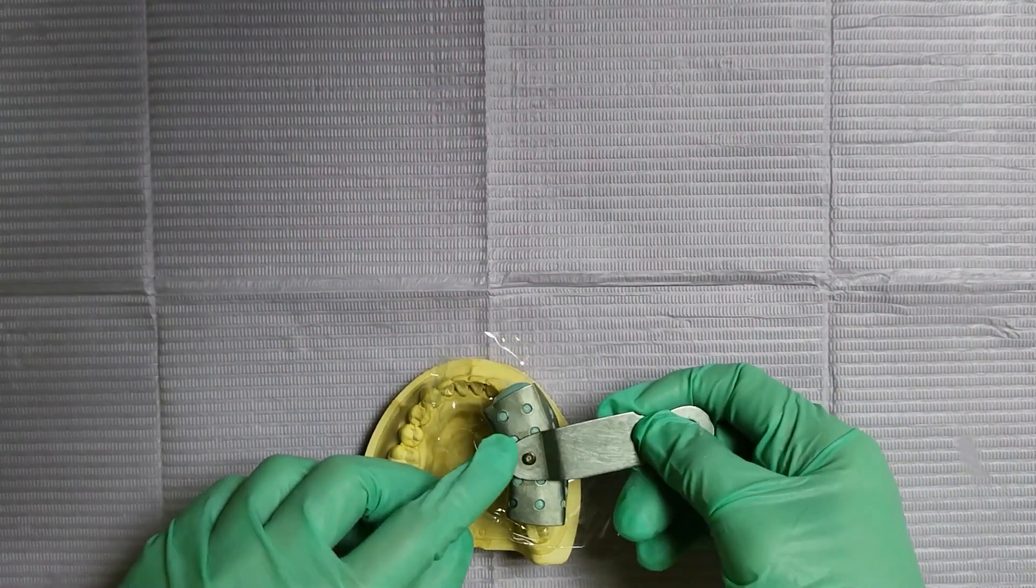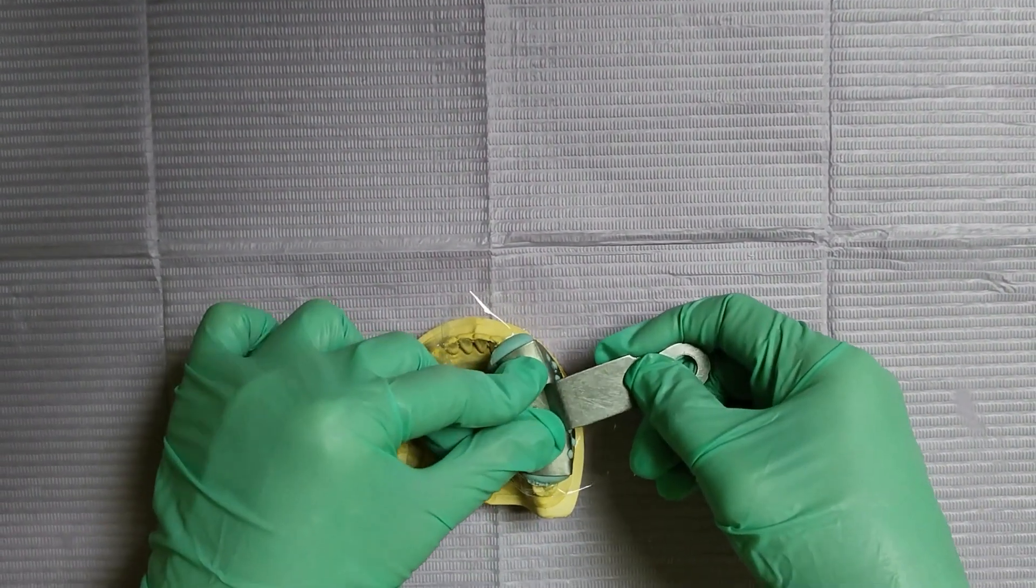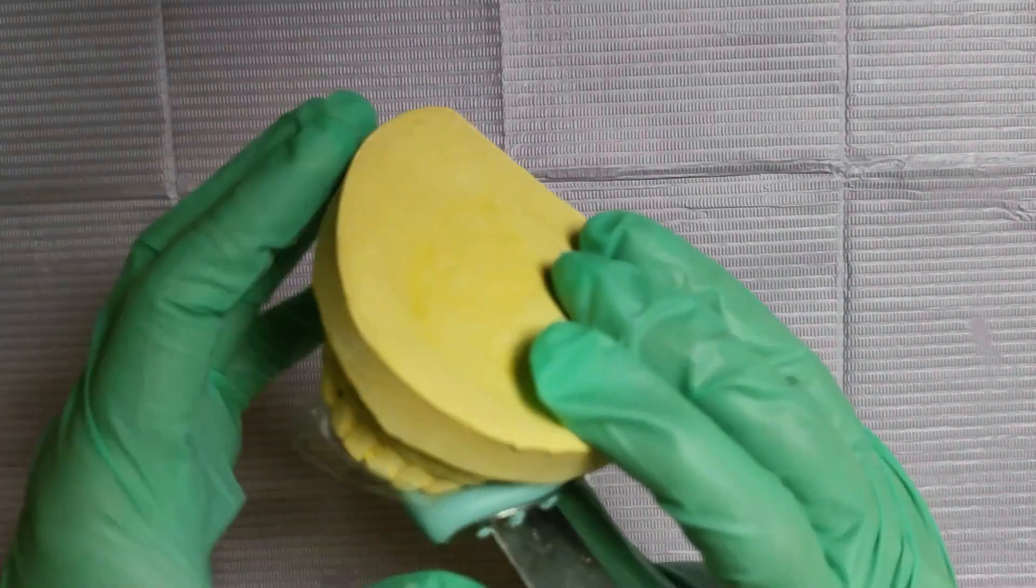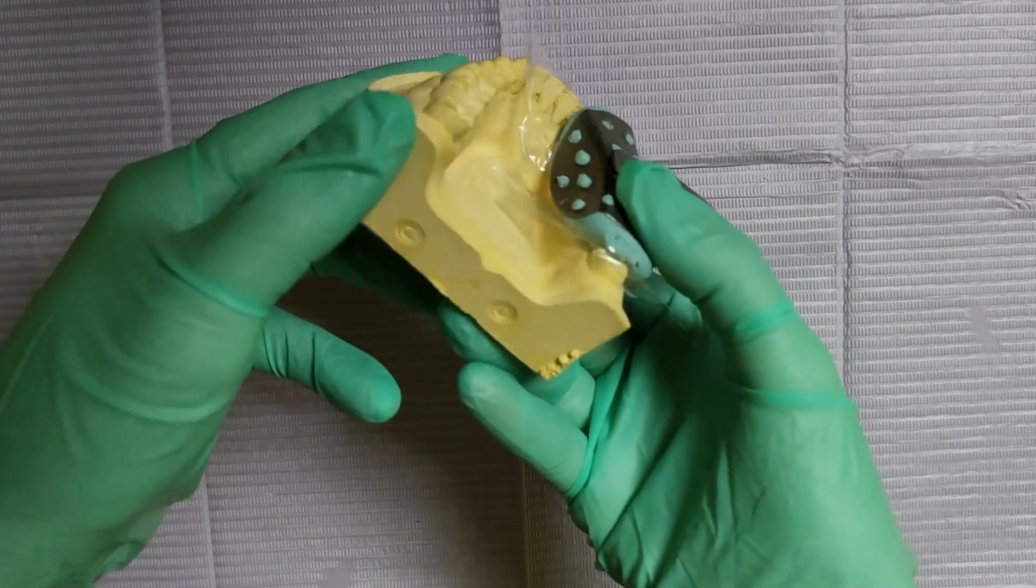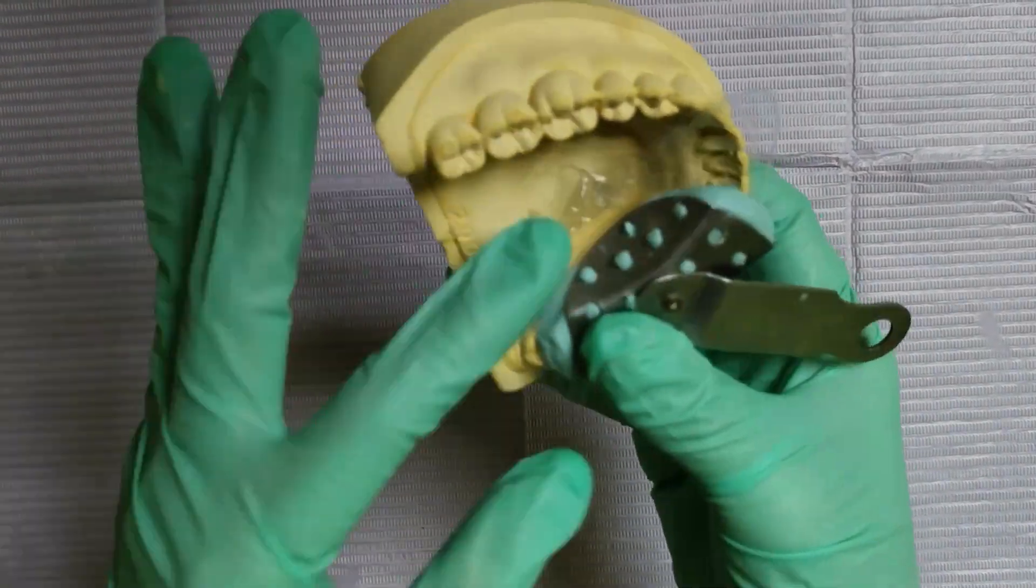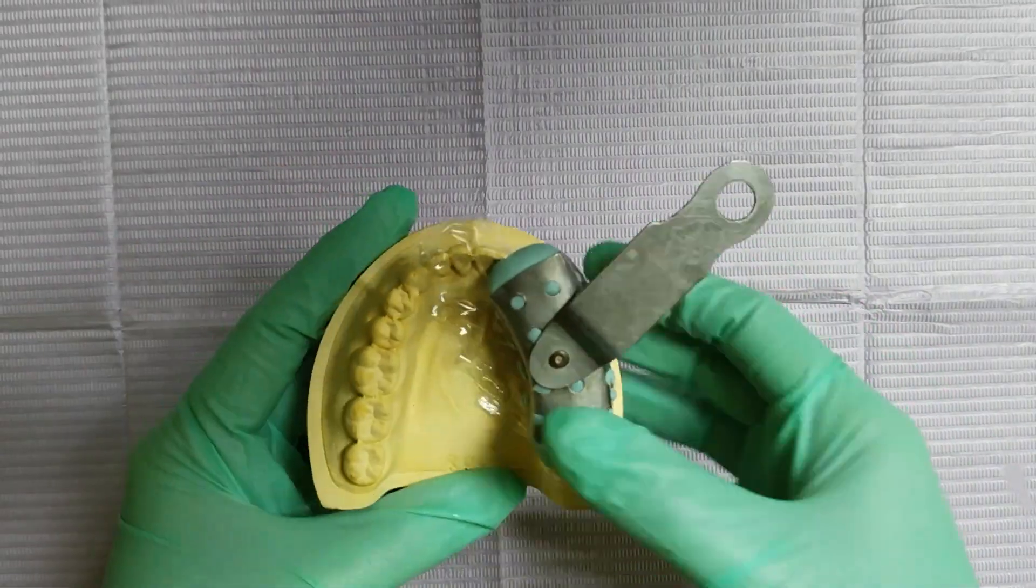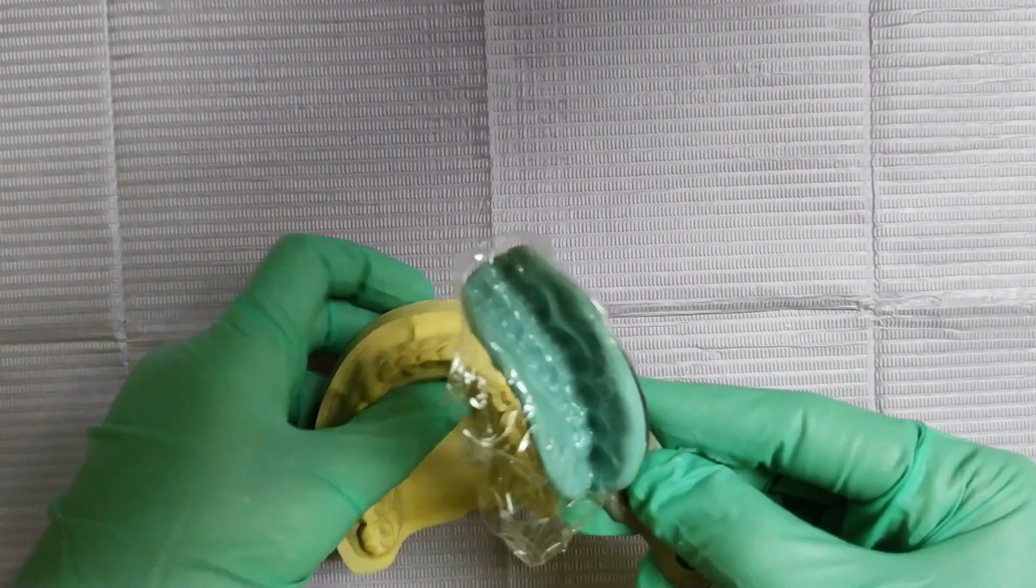Now you can make an impression on your model. Firmly place your tray down on the model and wait for about a minute so that the impression will partially set. After that, remove the impression from your model.